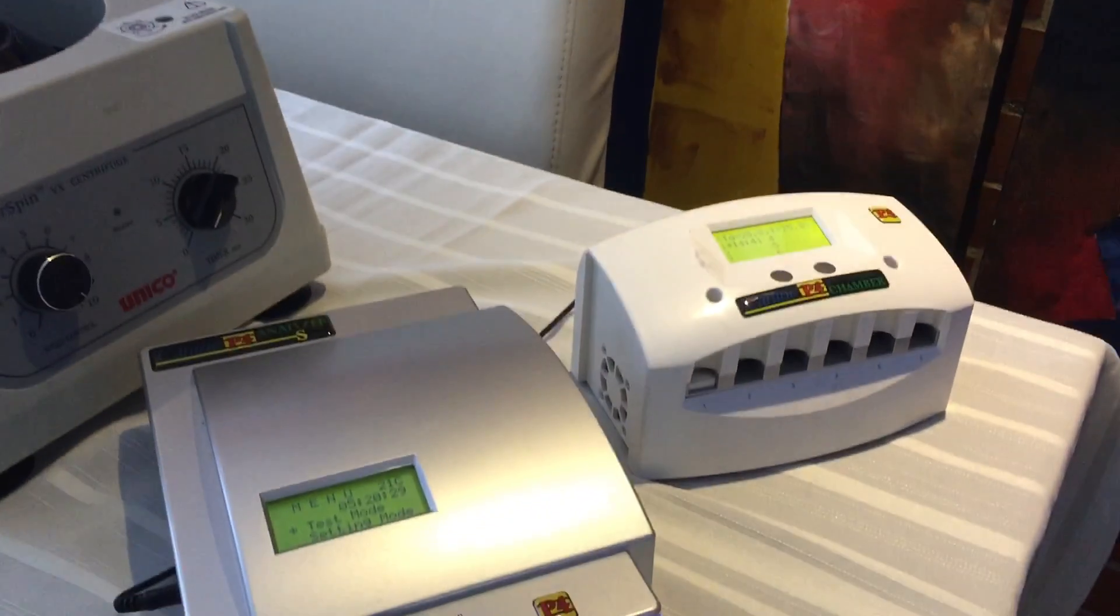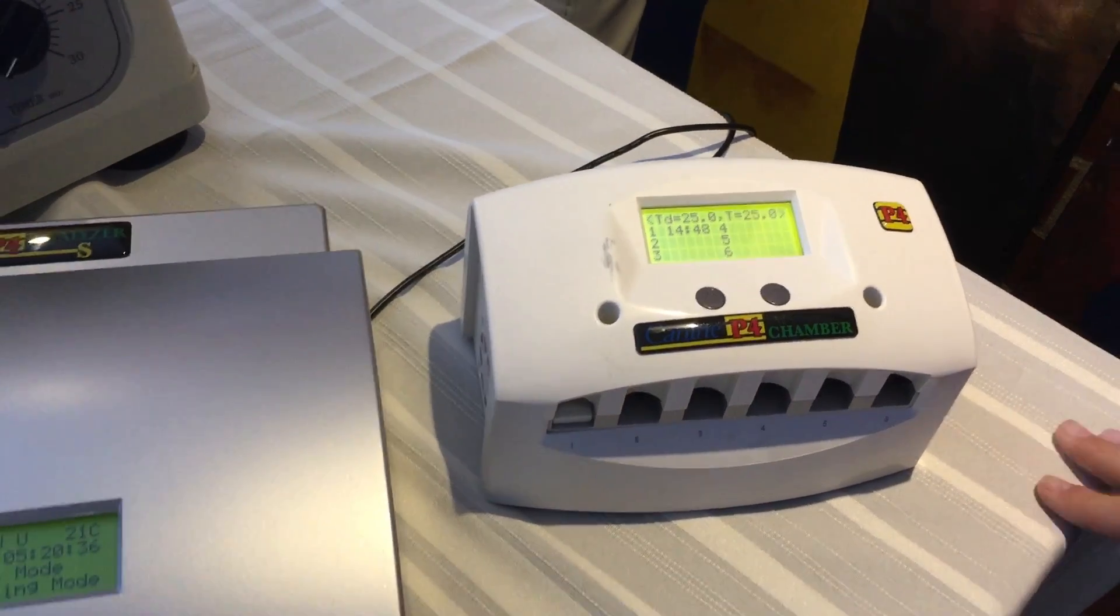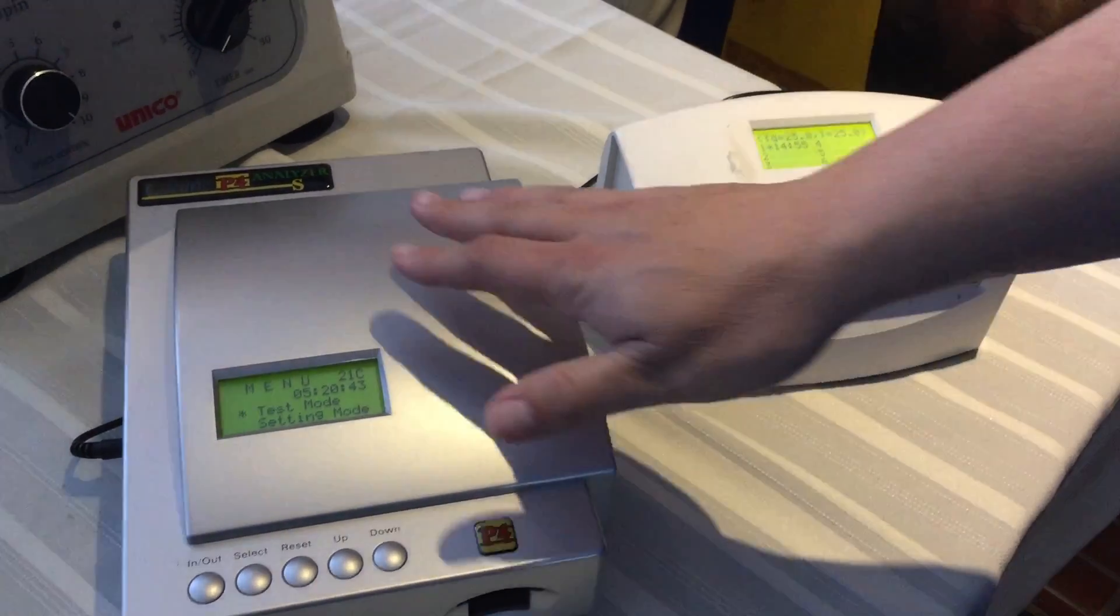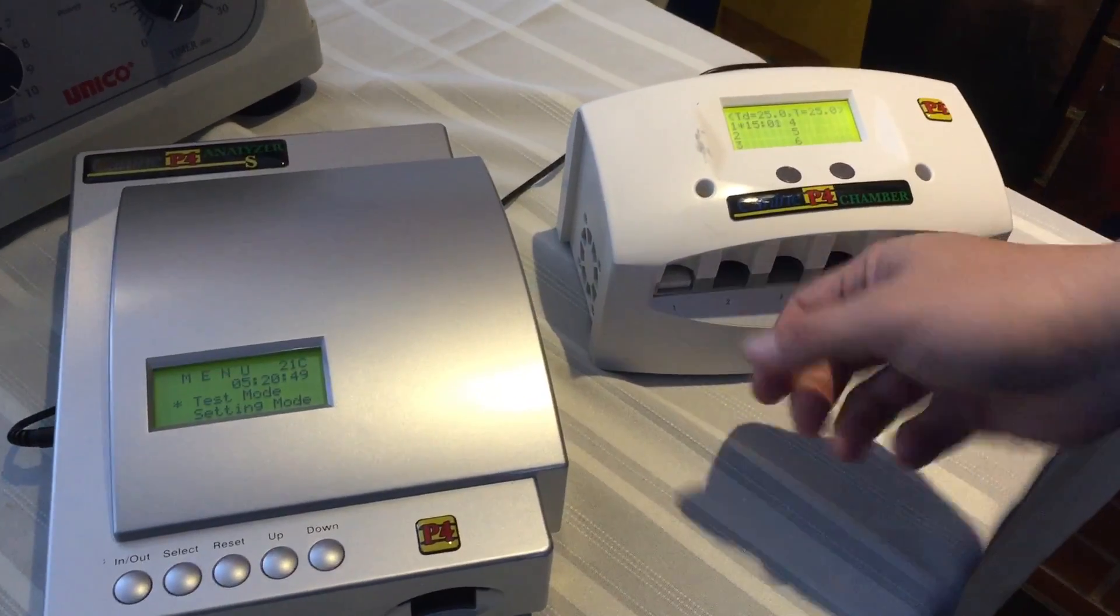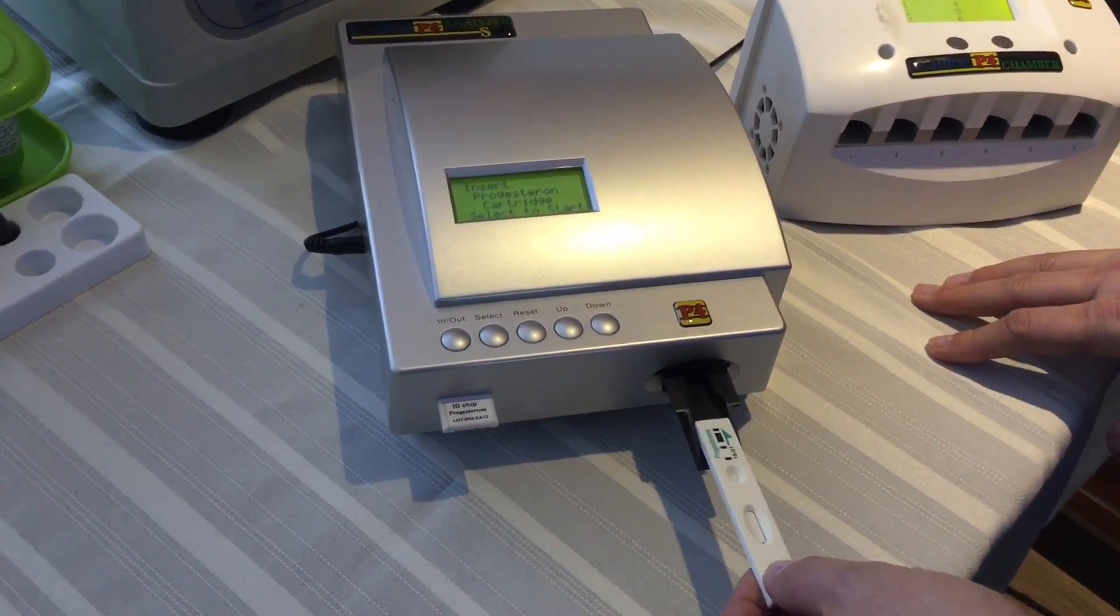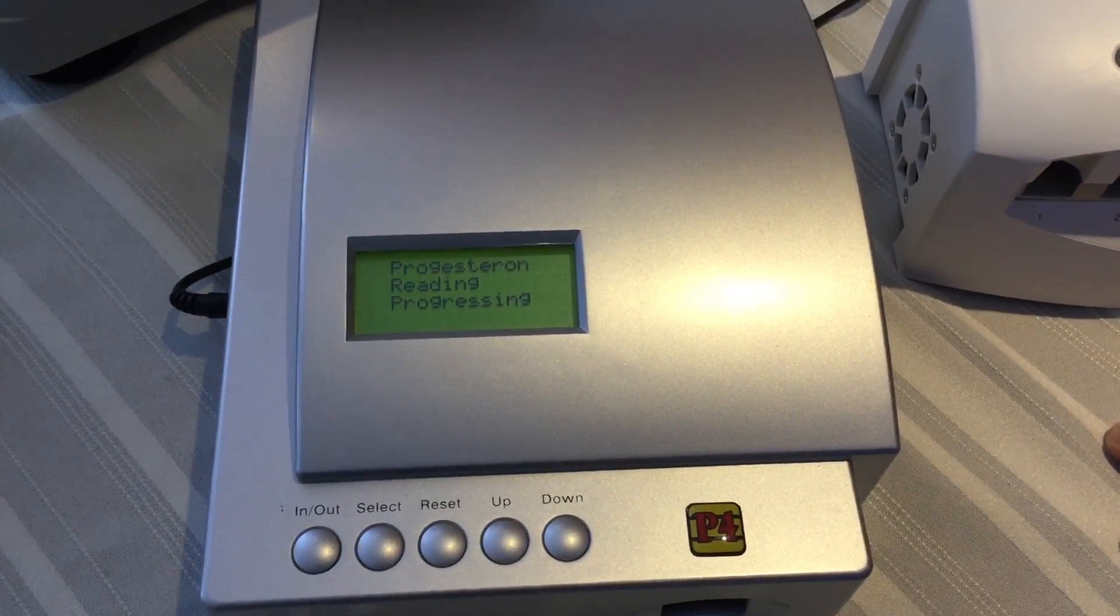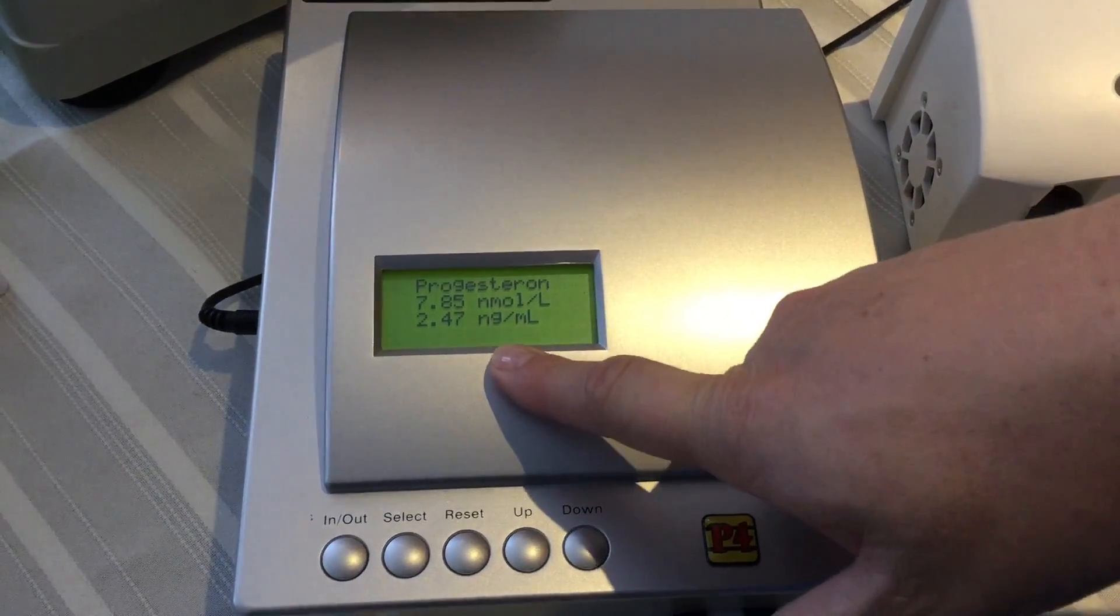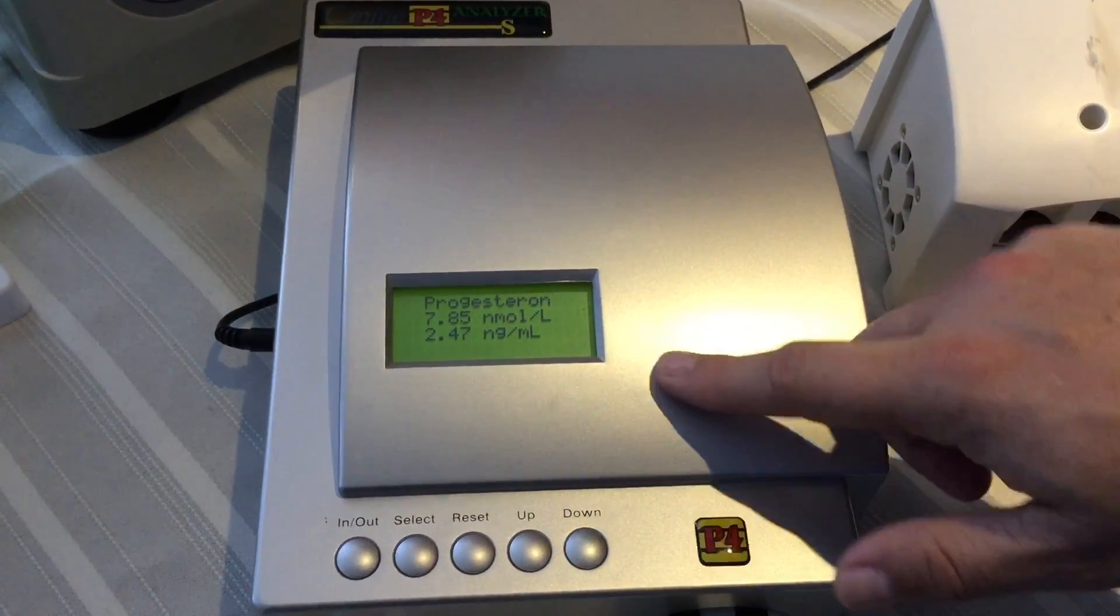So, the 15 minutes are almost up. Yesterday, the progesterone levels were at 1.48 and what I'm looking for is 5 nanograms, 5.0. So, as soon as the machine alarm goes off, we're going to put it in the P4 analyzer and see the rise. You press select. As you guys can see, today is at 2.47. So, the Draminsky was right. Yesterday, it was 9.70 in the Draminsky and it dropped to 3.80.